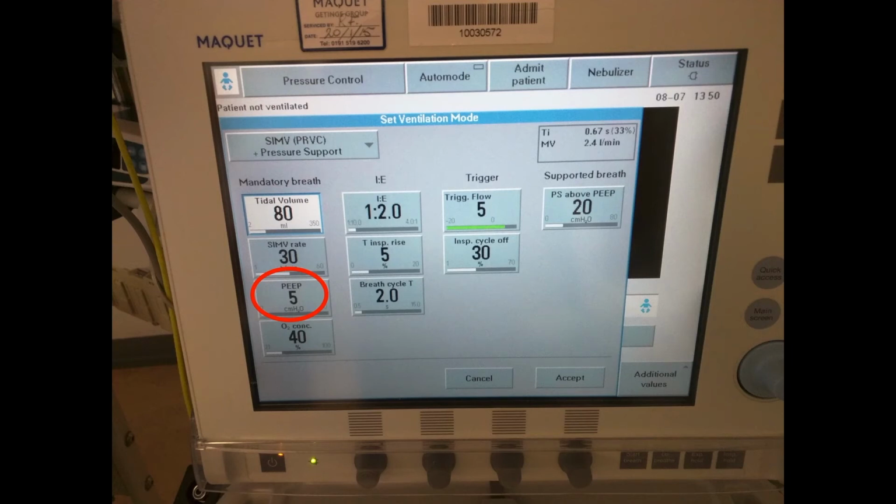It is primarily oxygenation. So if you're still struggling on that, I tend just to go up on the PEEP in steps of 2. Likewise, if you're somebody coming from neonates, you're taught that PEEP is evil, it causes pneumothoraces. It does if used inappropriately.